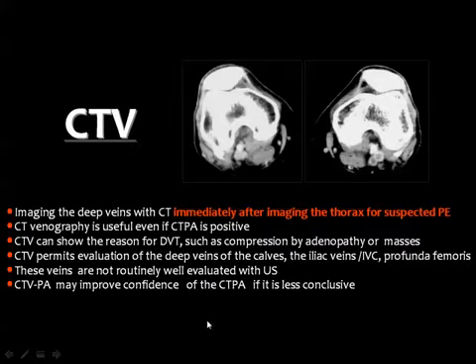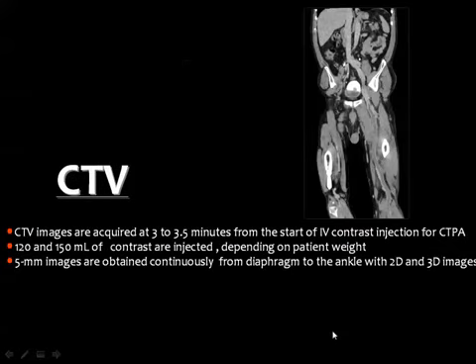And many times we may use the venogram to assess patients with suspected pulmonary embolism, and we inject contrast material intravenously to assess the pulmonary vascularity. Meanwhile, we can use the injected contrast material to assess the lower limb veins, taking into consideration that deep vein thrombosis in the lower limbs is the most common factor contributing to pulmonary emboli. Then if you scan the lower limbs at that time, after scanning the lung for the presence of pulmonary emboli, you may see filling defects within the veins of the lower limb indicative of deep vein thrombosis.